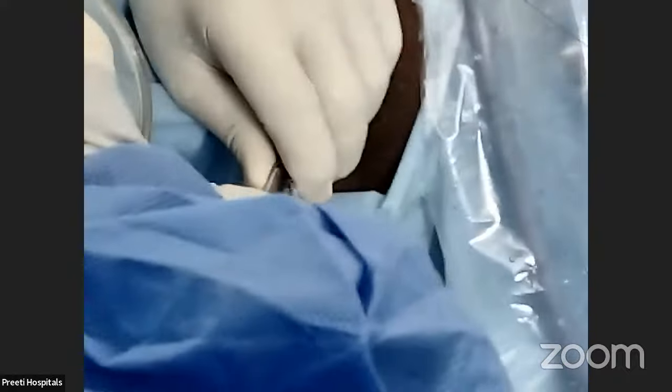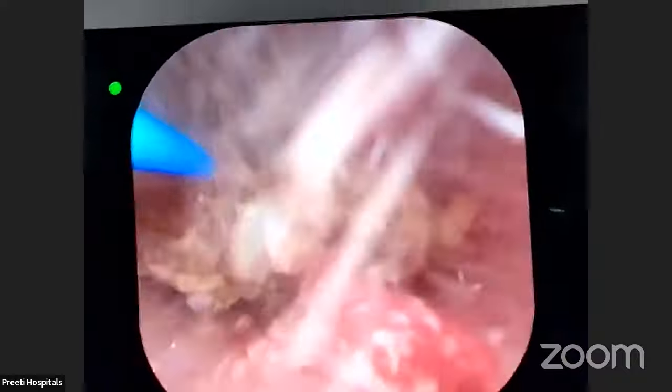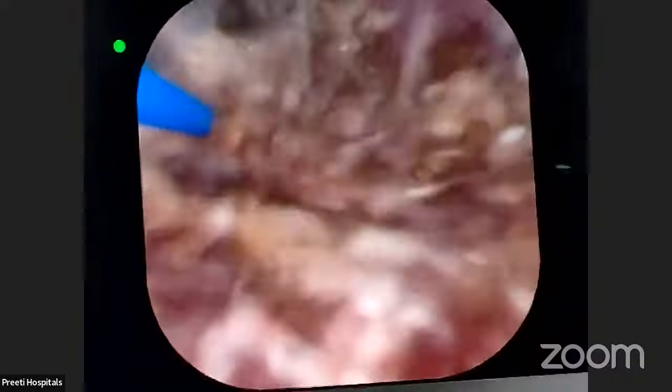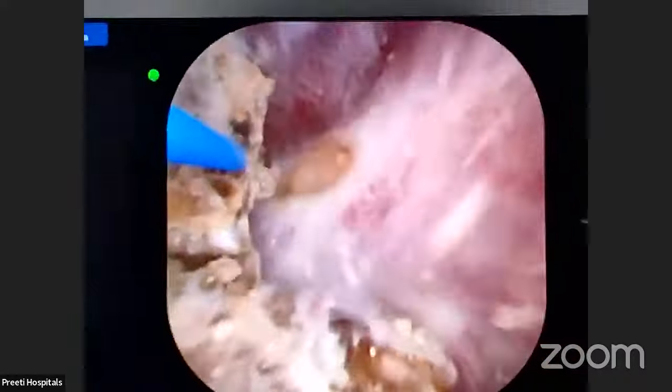Can you observe that collapsing? Completely collapsing. Enough. If you keep it collapsing for a long time, you will get blood. That is because of the capillaries, negative pressure, decompression. Now, for a stone of 1.5 centimeters, lasing time will be less than half an hour, eight minutes. See, if you inadvertently touch the mucosa, it may cause a burn. See, I caused a burn here.